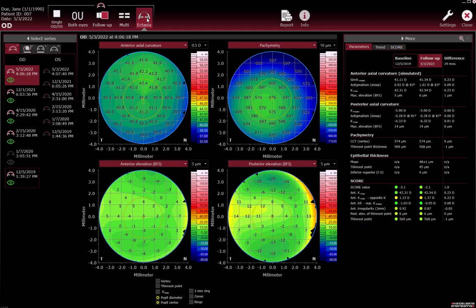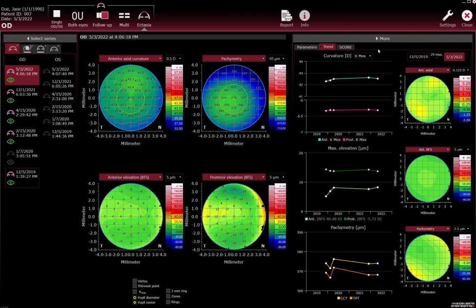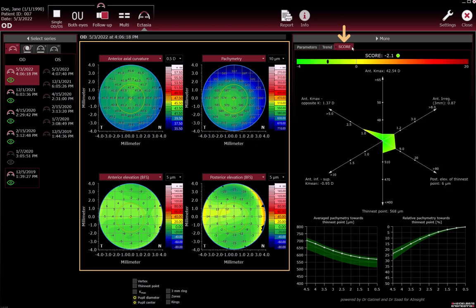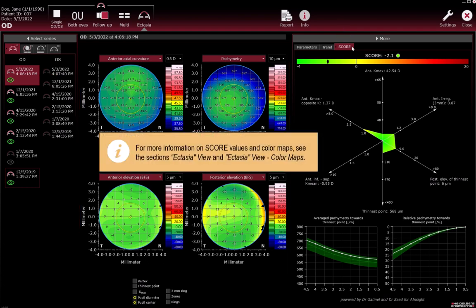The differences in measurements between follow-up and the baseline examination are displayed on the Parameters tab and visualised on the Trend tab. The colour map section and the Score tab display the measurements of the examination highlighted in red in the Select Series section. For more information on score values and colour maps, see the sections Ectasia view and Ectasia view colour maps.